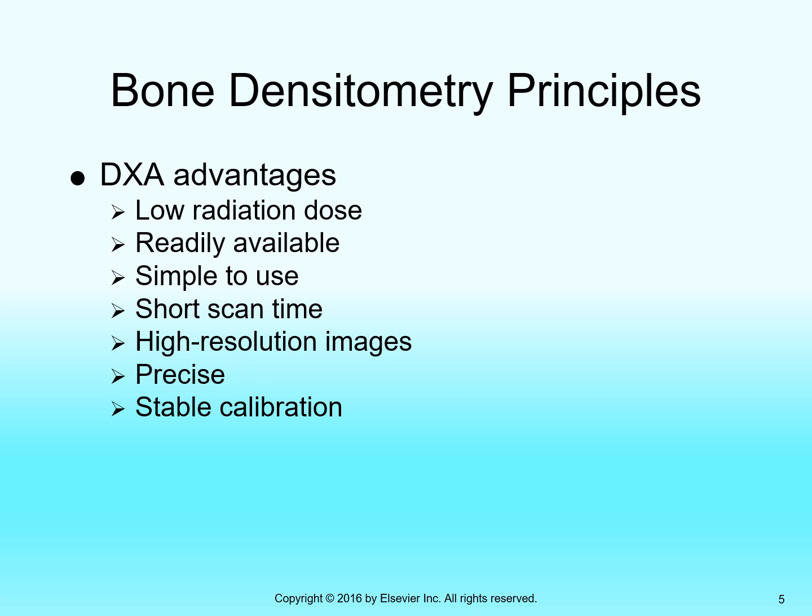But with aggressively tight collimation, we're not radiating a whole lot of tissue here. It's not like we're opening to 14 by 17. We call it a pencil beam because it's shaped like a pencil. It's still an expanding cone, so to speak, but a very narrow expansion.